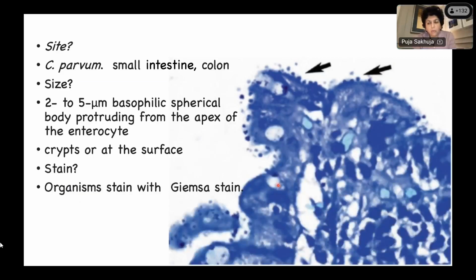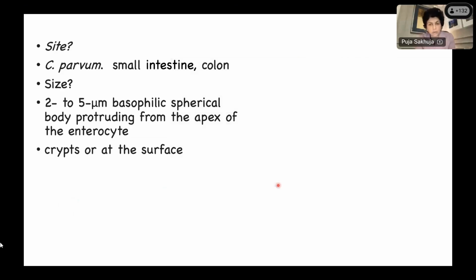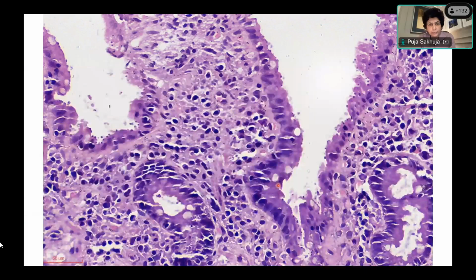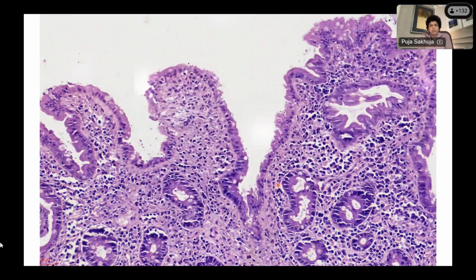So now, why is it not celiac? Let's go back to the photograph. Okay. What would we expect to see in celiac?